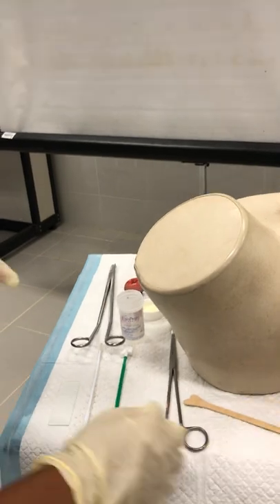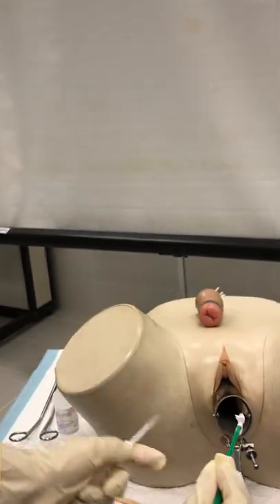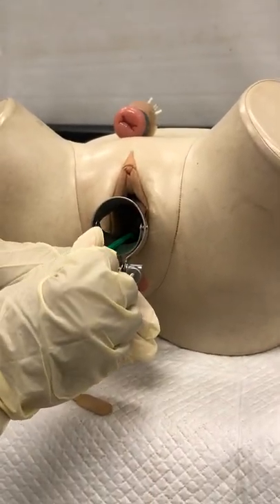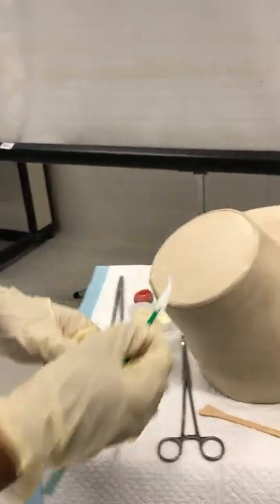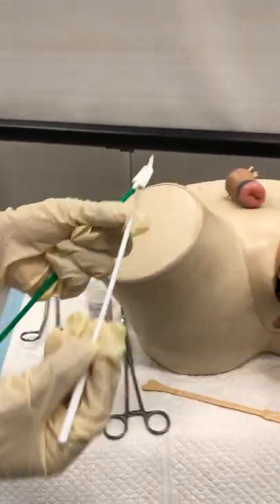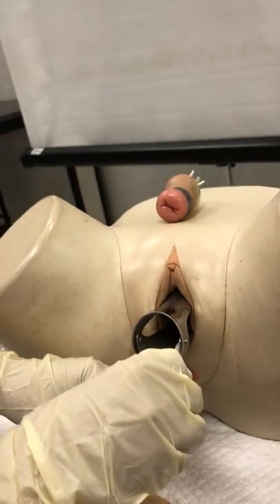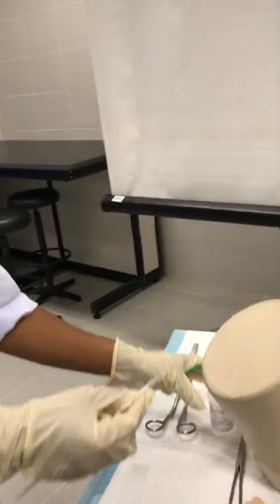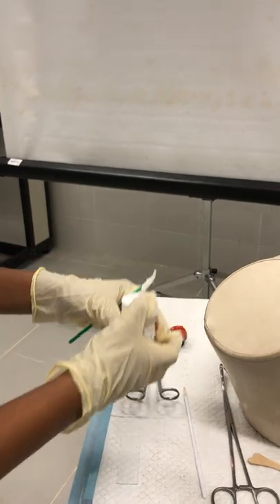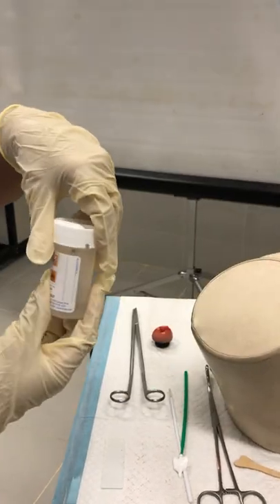For the liquid-based cytology technique, the procedure is similar. You touch the cytobrush on the ectocervix and turn 360 degrees. Then you can break the brush off inside the container. For the endocervix, use the smaller endocervical brush — insert it into the endocervical canal and turn 360 degrees. Then close the container and label it with the patient's particulars before sending it for pathological examination.